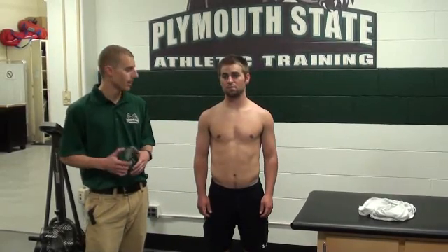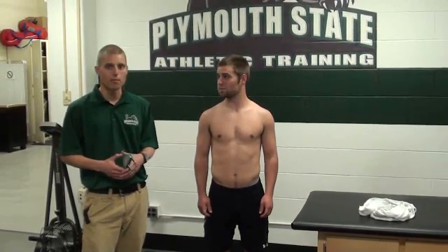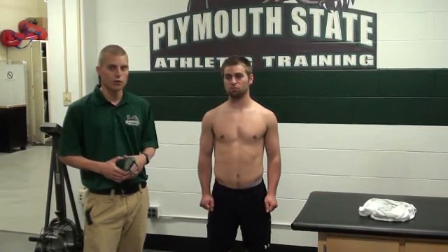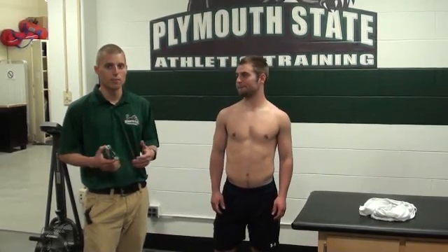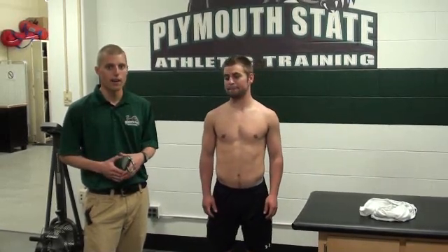Hi, I'm from Plymouth State. We're going to assess body fat percentage and body composition using skinfold caliper measurements. We do this at varying different sites — today we're going to show you five sites that we typically use. We take the numbers and the information and plug that into an equation to get the percent body fat.